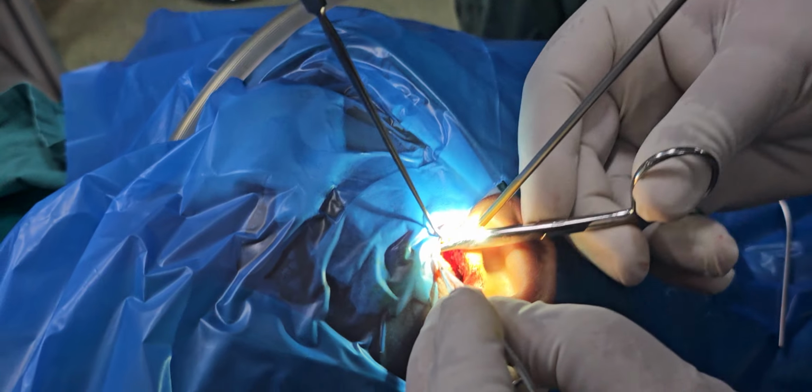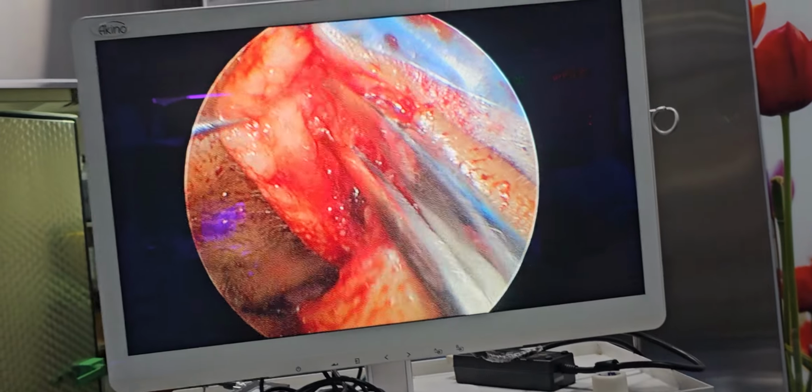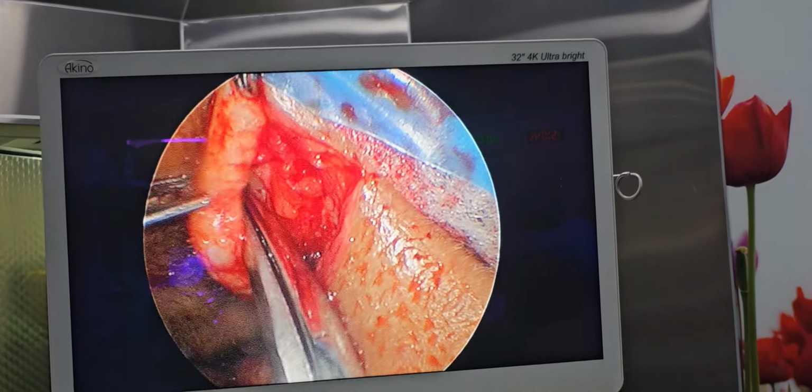from the same position. See this? Take a small video of that. You will understand. See this. This is the cartilage.